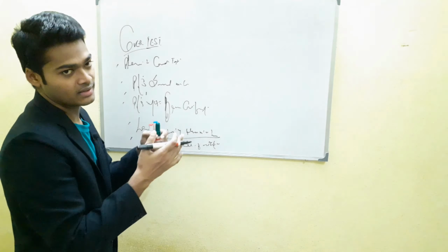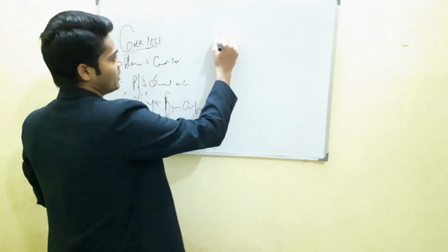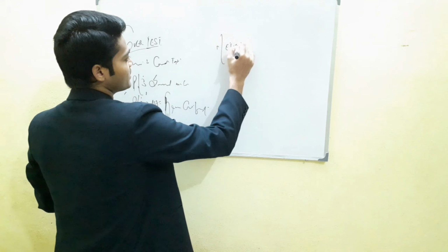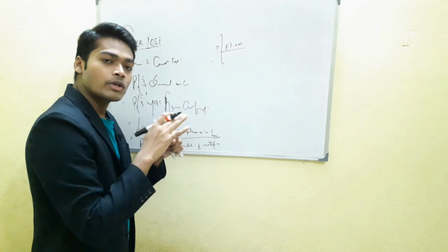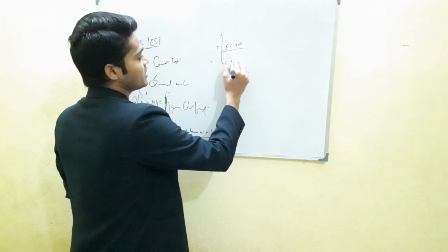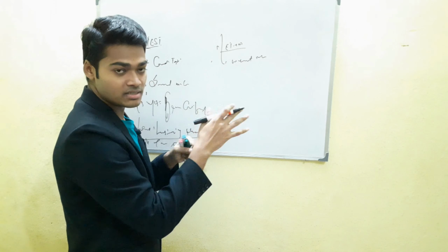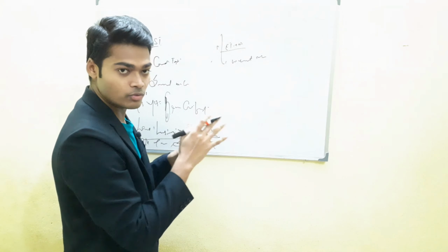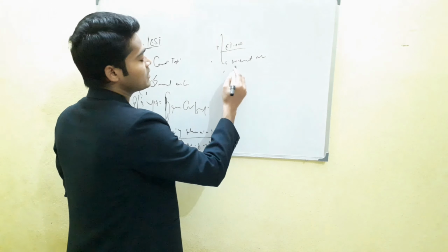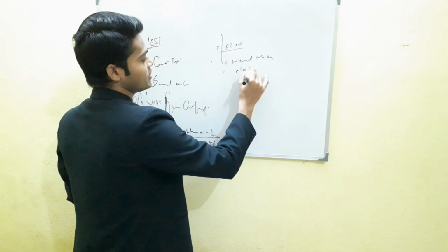Now come to the method, meaning how we perform. If we talk about the method, just simply think like that. You can perform this test with the patient wearing the habitual spectacles or the corrective refractive error, whatever you got, right? And not only distance but near also, right?